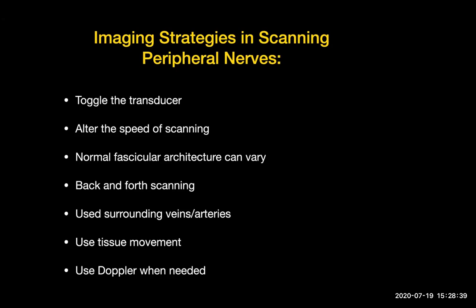This is very, very important because right now we're also using ultrasound to identify fascicles that happen in hereditary sensory diseases, like the ones that you see in very young patients, congenital problems. And then, of course, you can use Doppler when it is needed.